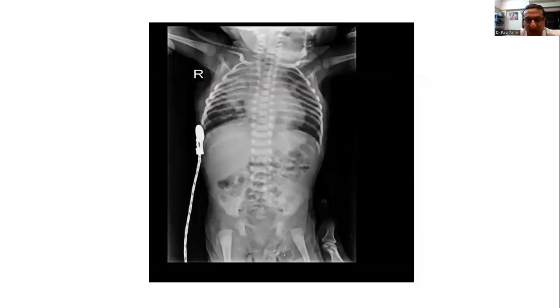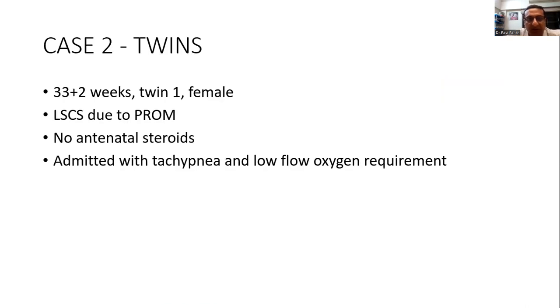Thank you. So I'll go to my second case. Always when we learn any new procedure or technique, like ultrasound, we try to correlate clinically. What I would do is give the conclusion, but first what happened with this case gradually. What used to happen in our NICUs, whenever we found any premature baby with respiratory distress, was that the clinical flow chart for surfactant said that anybody on oxygen with more than 40%, we used to give the surfactant.